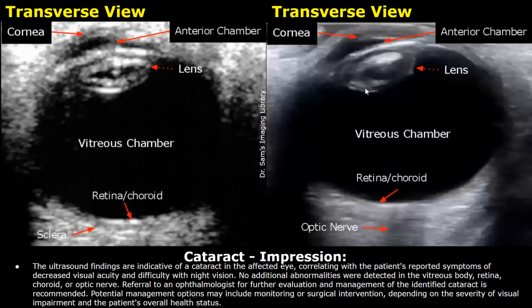Referral to an ophthalmologist for further evaluation and management of the identified cataract is recommended. Potential management options may include monitoring or surgical intervention, depending on the severity of visual impairment and the patient's overall health status.